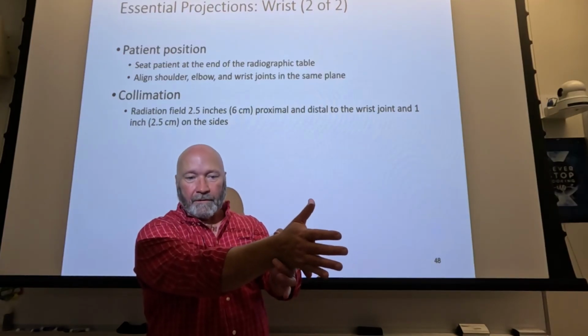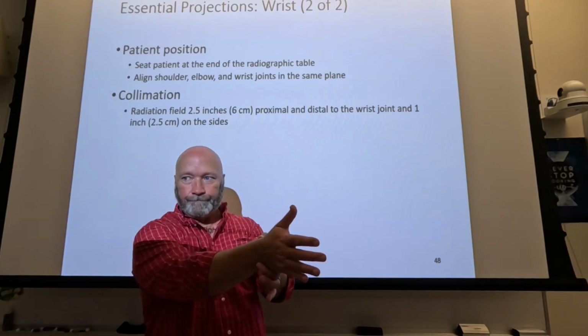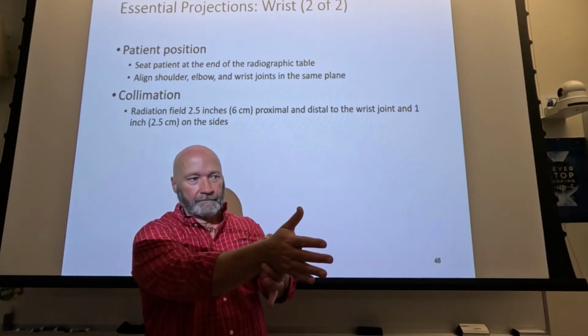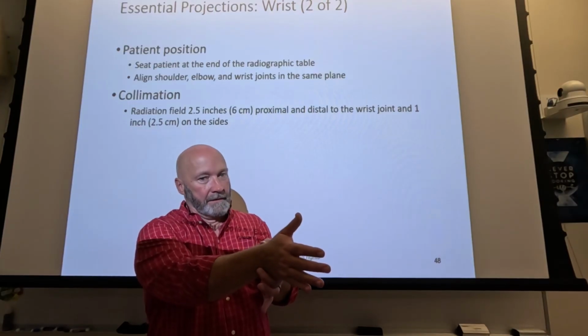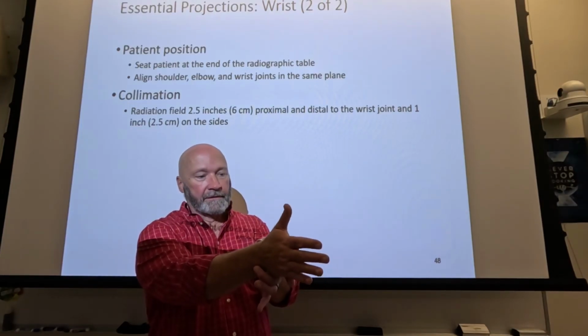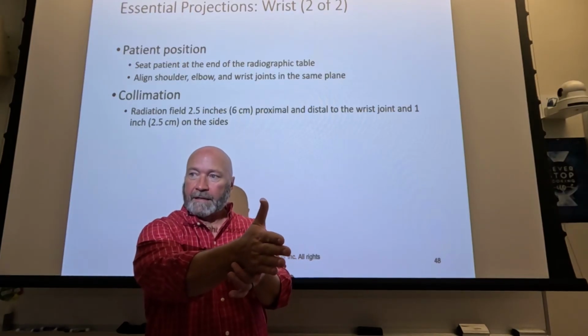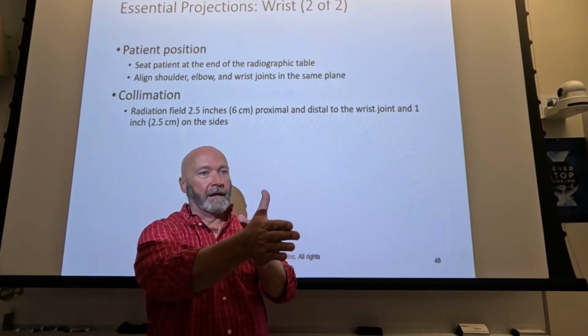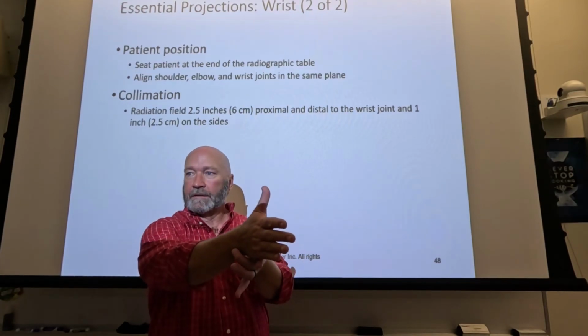Okay? Now, holding on to both of those, what do you feel? If you've got a finger on both of those at the same time, they're off, right. So if your hand is straight up and down, and you can use the palm of the hand as a good guide for a lateral of the hand, doesn't mean you're going to get a good lateral of the wrist.